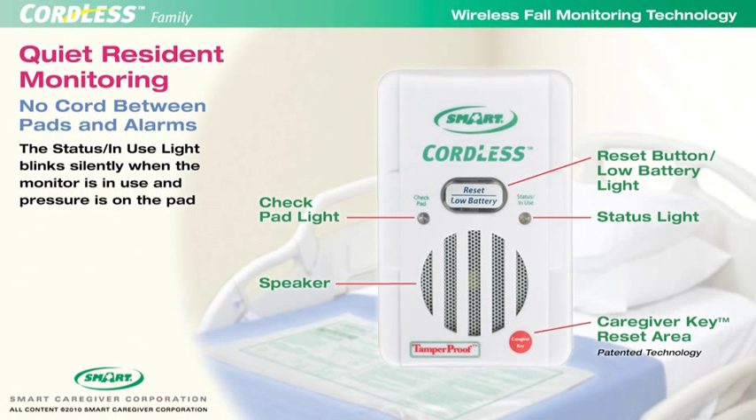When the system is in use and pressure is on the cordless pad, the status light will blink silently every 4 seconds, giving caregivers a clear visual indicator that the system is in use.